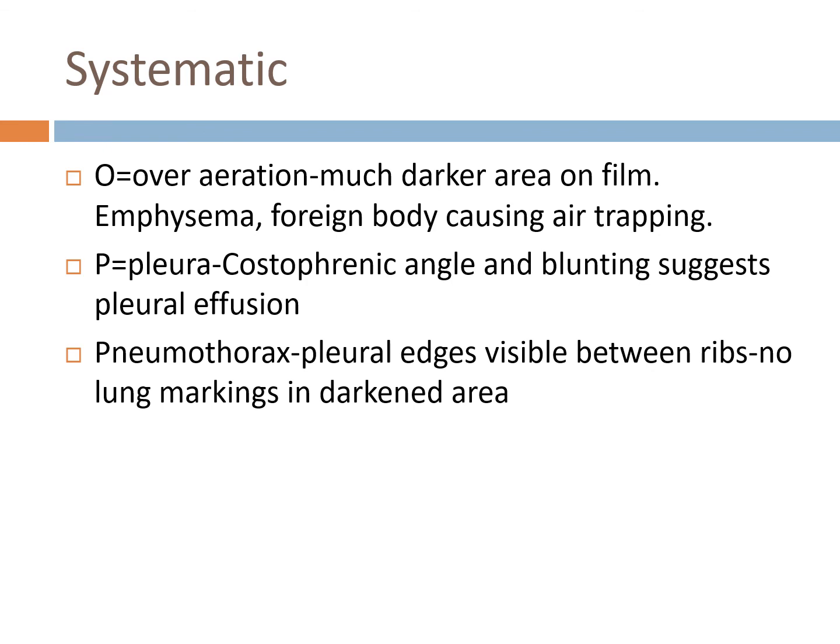Again, the air bronchograms, because I do believe there's an exam question on this coming up. An air bronchogram is a tubular outline of an airway made visible by the filling of the surrounding alveoli by fluid or inflammatory exudates.